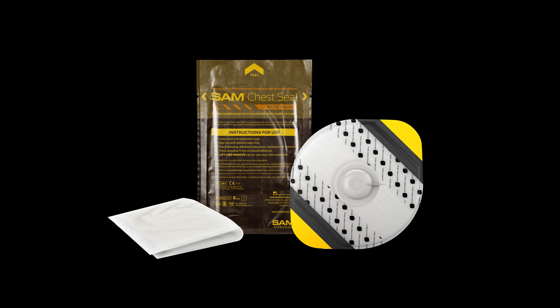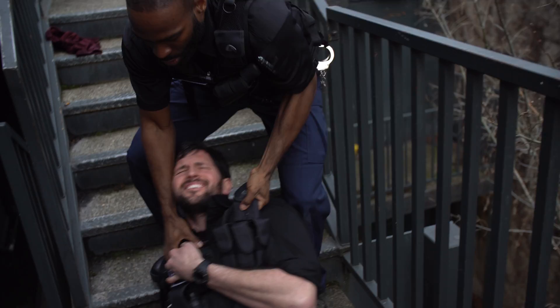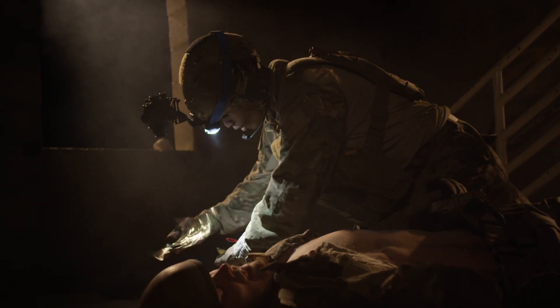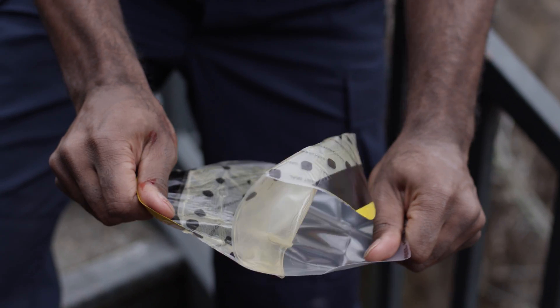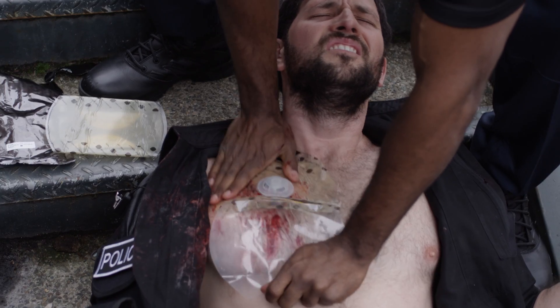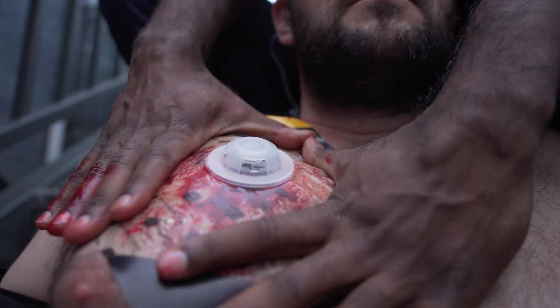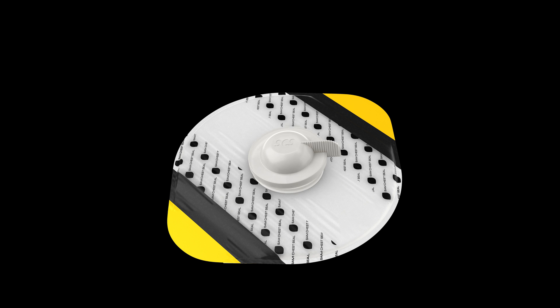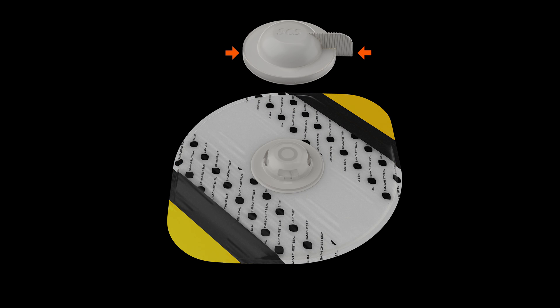This is SAM Chest Seal with Valve by SAM Medical. SAM Chest Seal with Valve includes one valved SAM Chest Seal, one valve cap, and a 5x9 inch dressing.